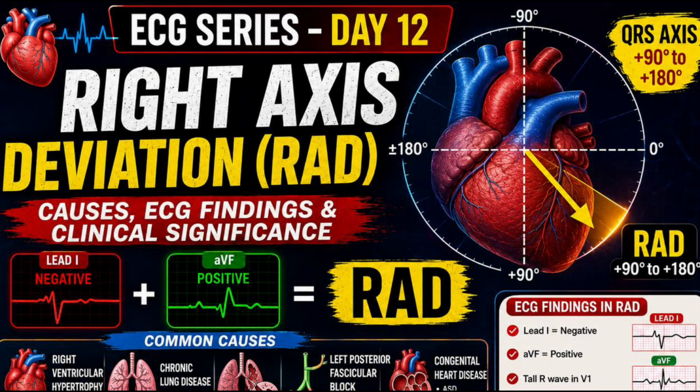So, today we are going to learn a very important topic, that is right axis deviation. This right axis deviation is an important ECG finding that often indicates right-sided heart disease, pulmonary disorders, or conduction abnormalities. By the end of this lecture, you will be able to identify right axis deviation within a few seconds and understand its clinical significance. So, without wasting time, let's begin.